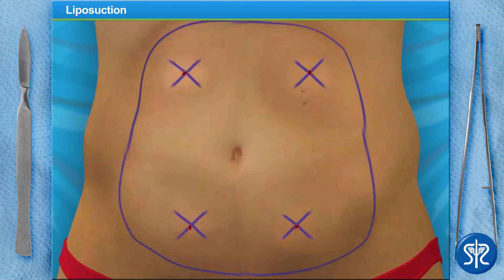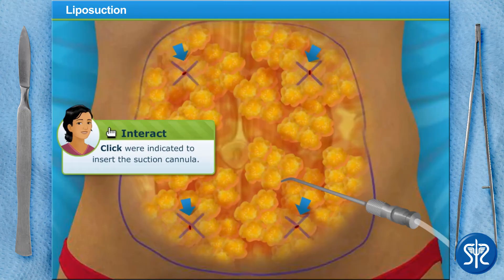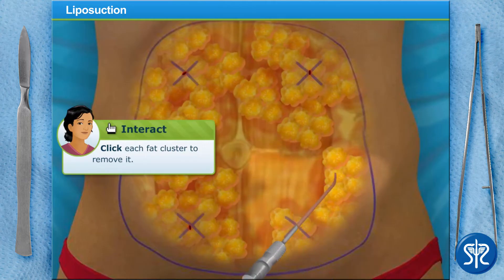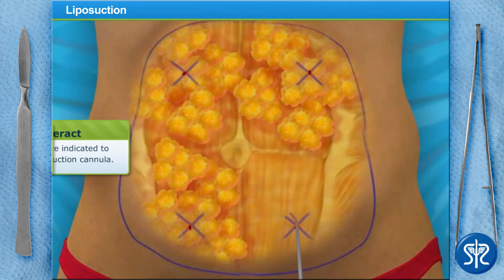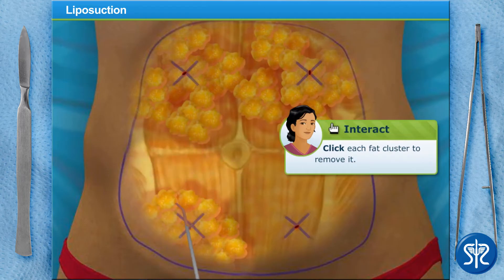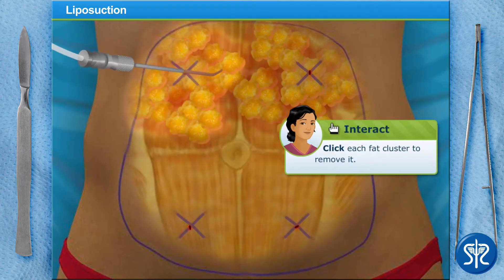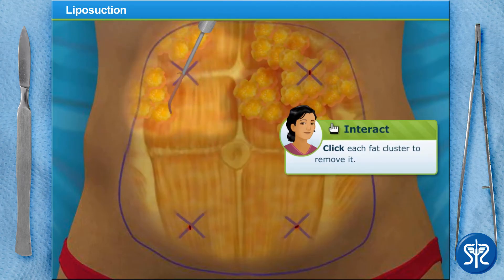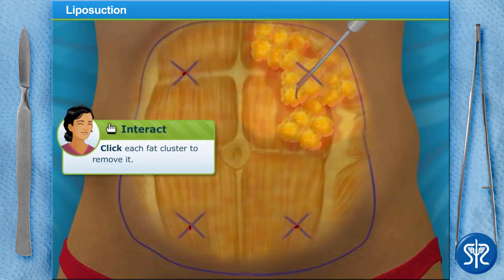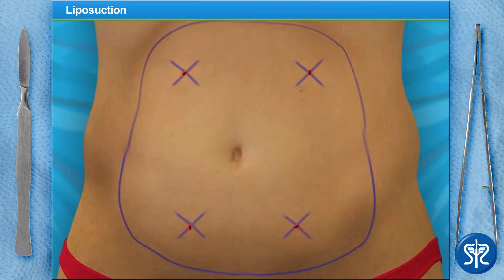Excellent job! Now that we've injected the tumescent fluid, let's begin the liposuction. Use the suction cannula to remove the fat deposits from the patient. You're a natural! Have you ever considered a career in the medical field?